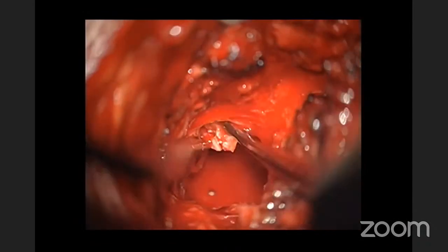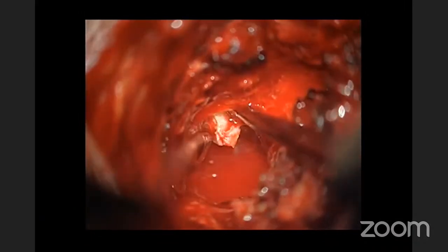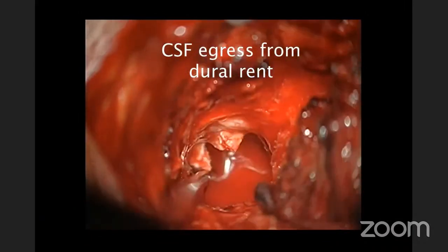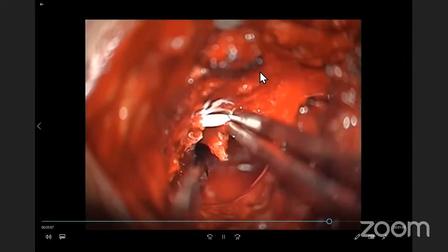So now you can see that it is now lax. And there was a dural tear in this case, a part of the dura was torn. So we put in a dura gen.